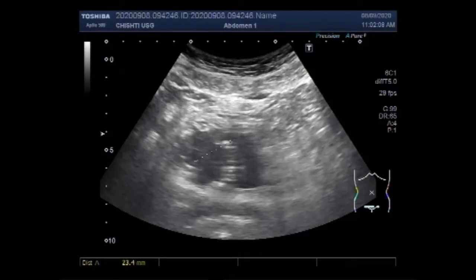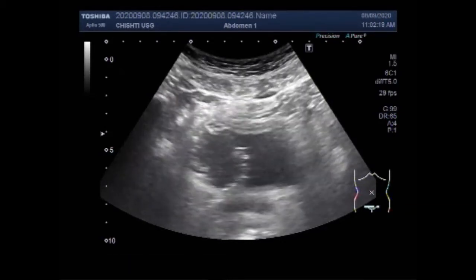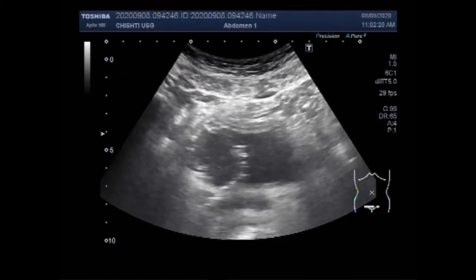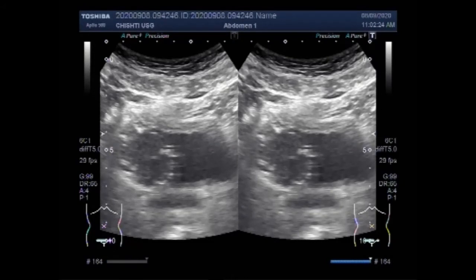Now you can see the size of the mass. It measures about 36.7 mm x 38.9 mm — quite a large mass. Sonography enables detection of 95% of exophytic lesions within the urinary bladder with a diameter exceeding 5 mm.